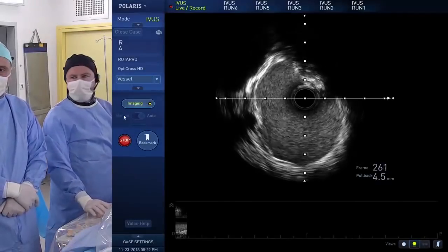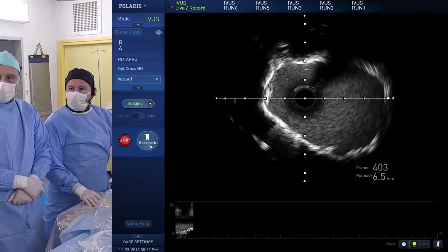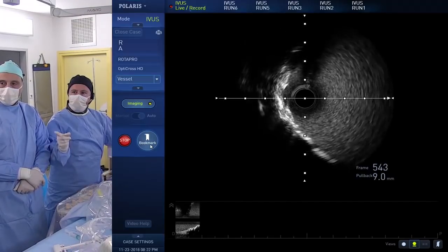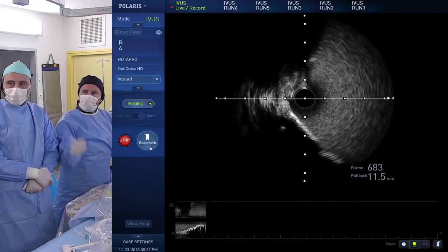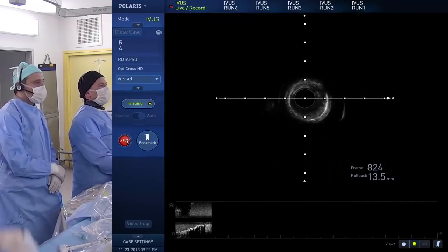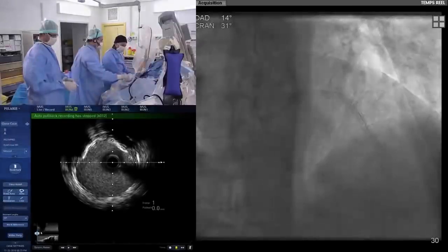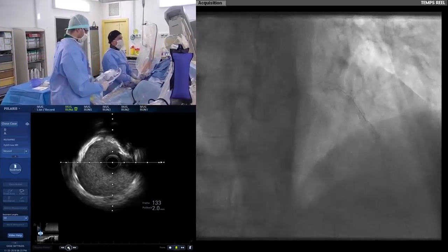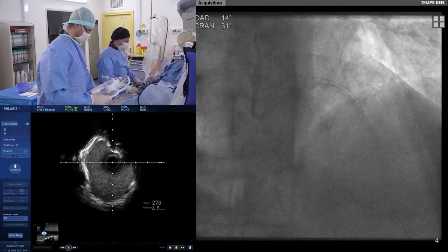Okay, there's been a comment about whether the ostium of the left main does have any stent struts. Yes, it has. You can see there is a strut inside the aorta. At this part, you can see a strut. It is definitely improved. I think this is okay. Yeah, I think so too. Okay, you are sure because you have dilatation with a 5.5 non-compliant balloon. Okay, so now we will do the final shot.